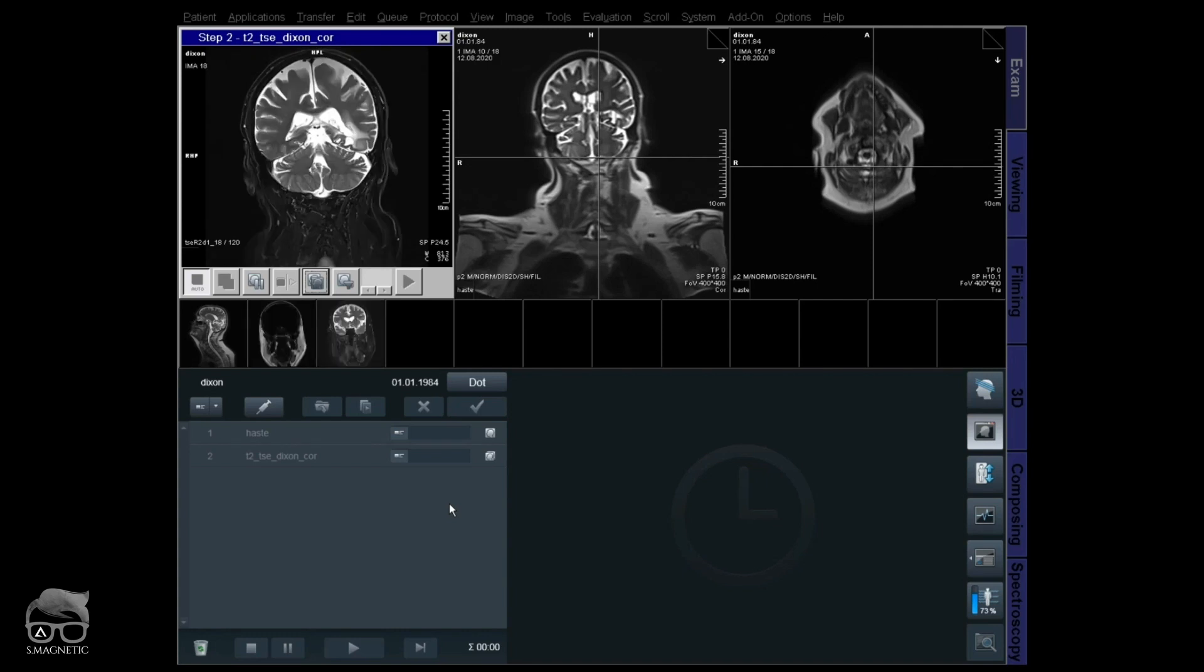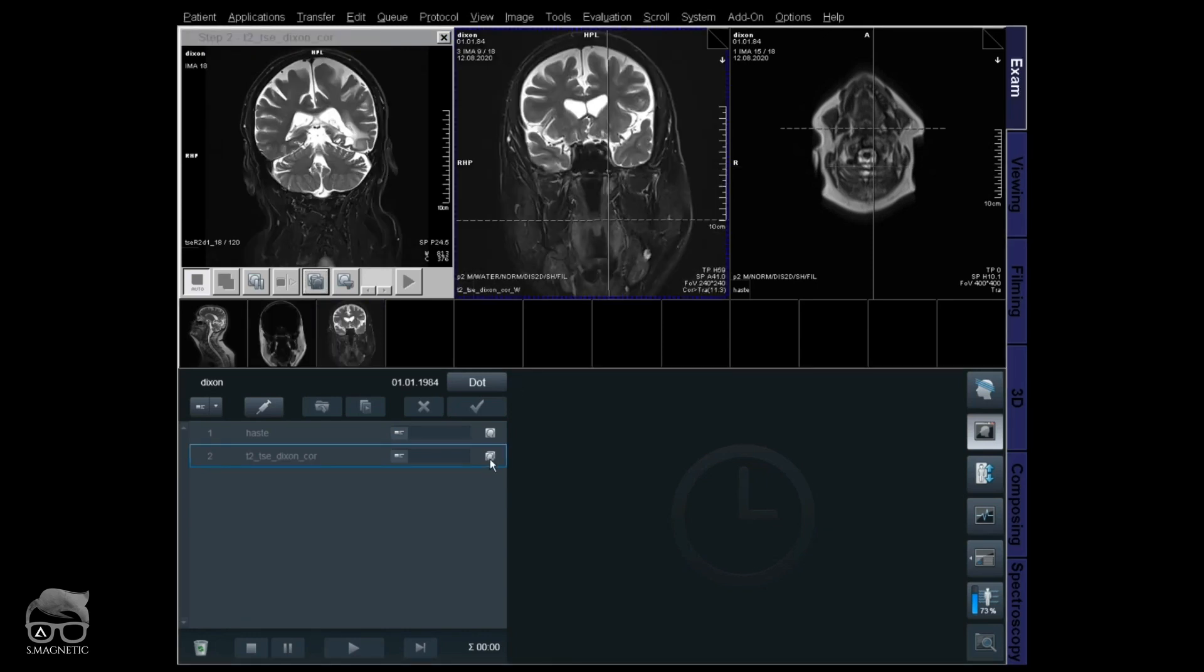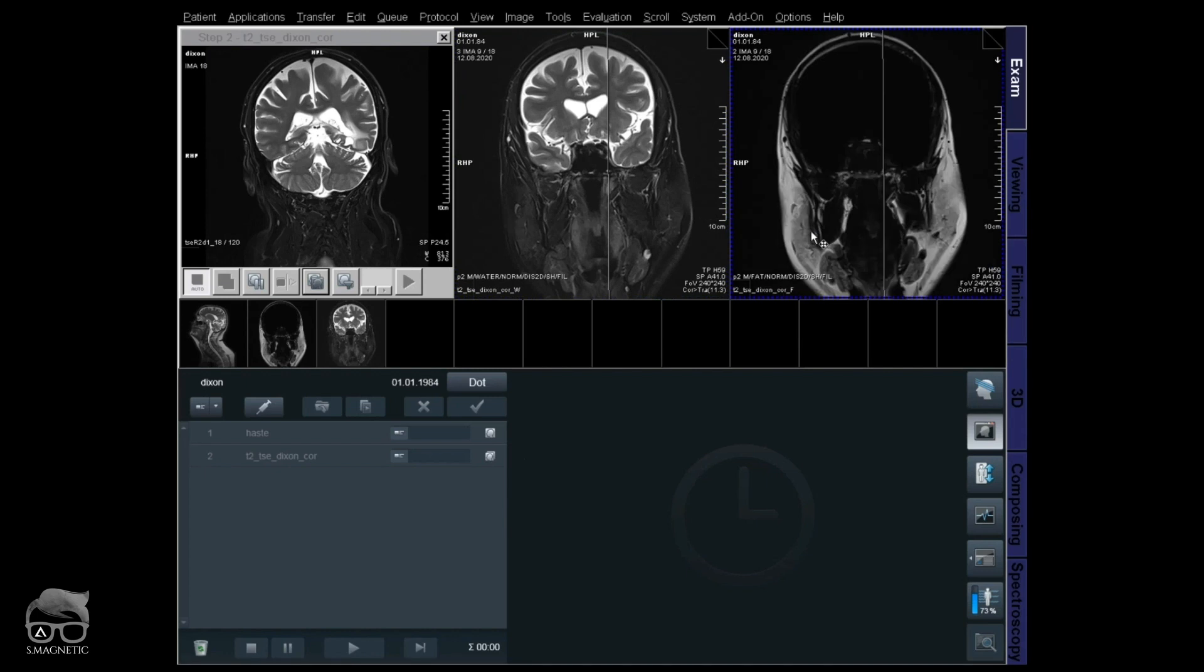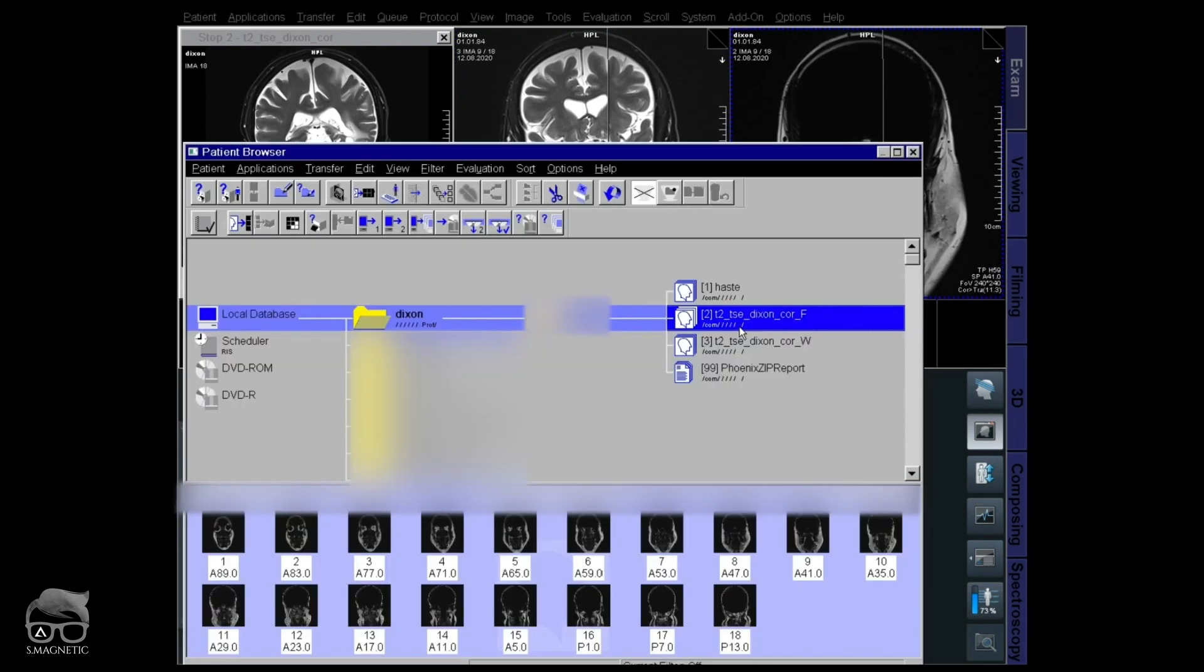As you can see there, we have water only and then we have the fat only. So we're missing the in and out of phase, right? We're missing the in and out of phase. We only have fat and water only.